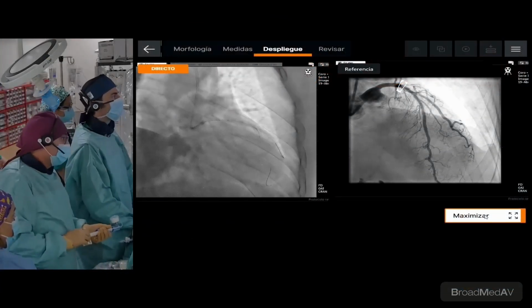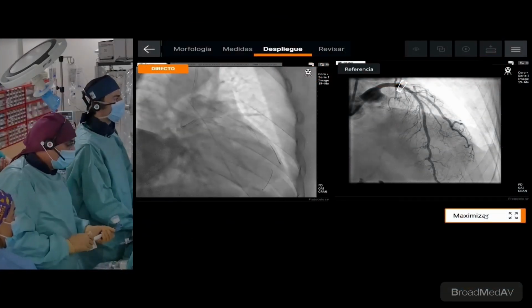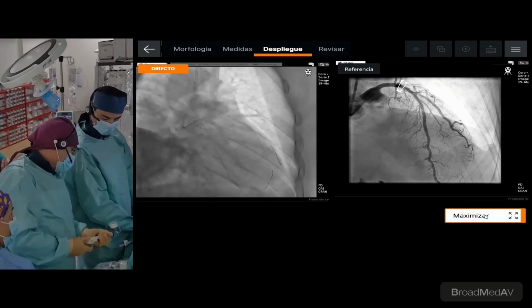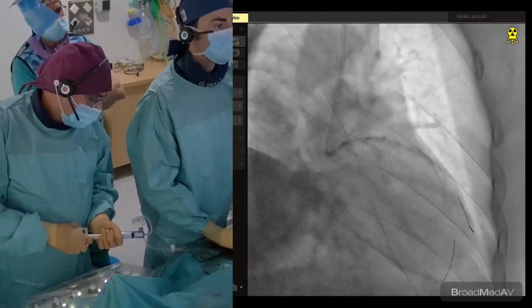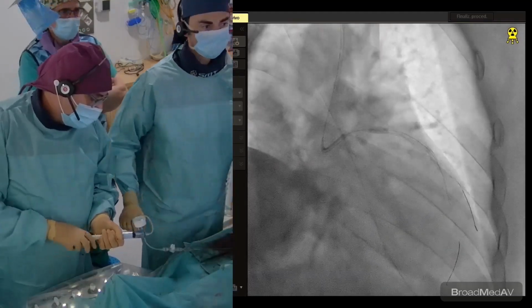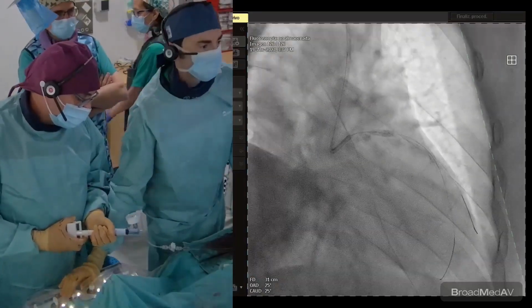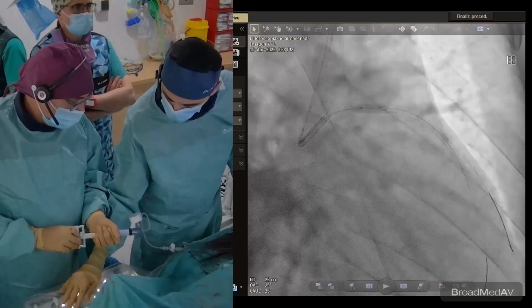Sube. No te muevas ahora, por favor. Muy importante. No hables ahora, no te muevas. 12, 4.0. No veo nada. Venga, 12, 2, pero vas a 2, vale. 6, 8, 10, 12, 5 seconds. Perfecto. Go down.